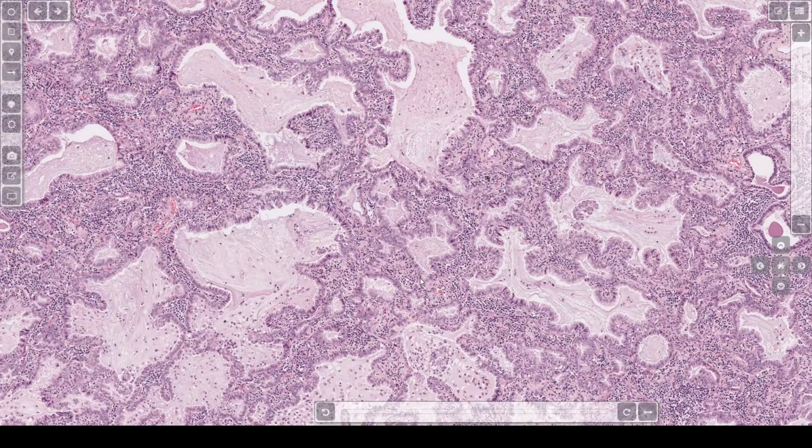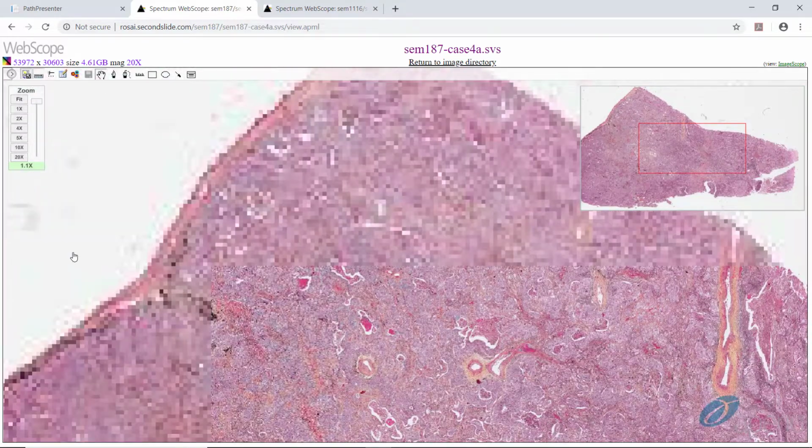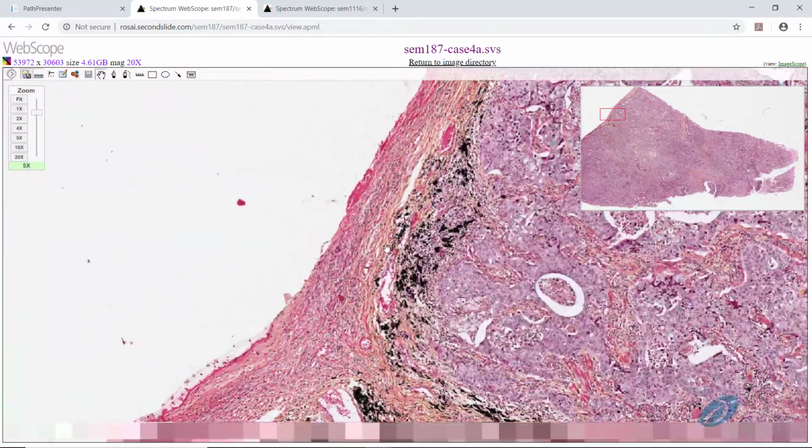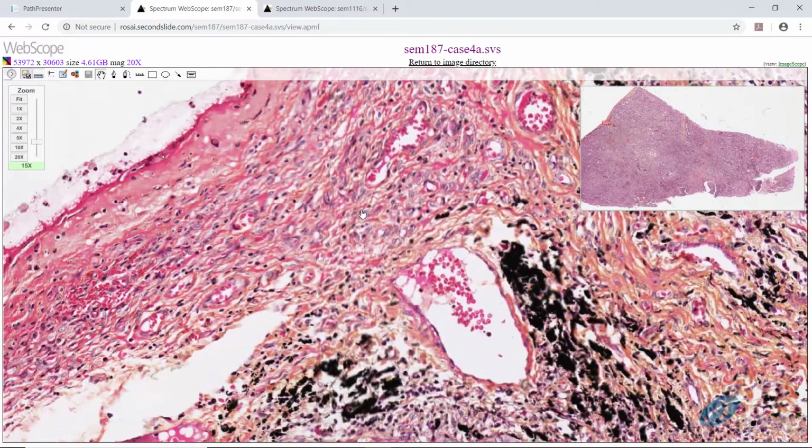Slide 25 is on a separate link. This is a lung tumor biopsy that is composed almost entirely of tumor. Here on the upper left, there are small amounts of normal pleura. Let's take a look. You can see there is collagenous tissue in the pleura.